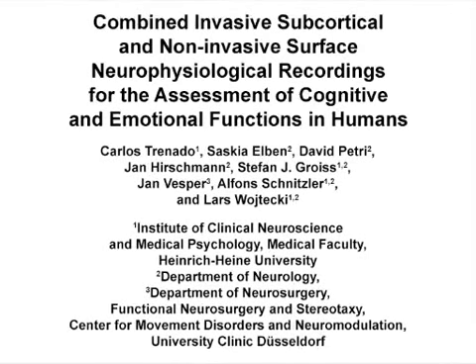The overall goal of this procedure is to assess cognitive and emotional functions of interacting brain structures through simultaneous recordings from both deep and surface neuronal sources. This method can help answer key questions in human neurophysiology, such as the relationship between brain activity patterns and brain function, especially regarding deep-seated, barely accessible brain areas.